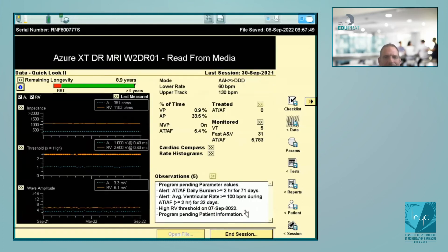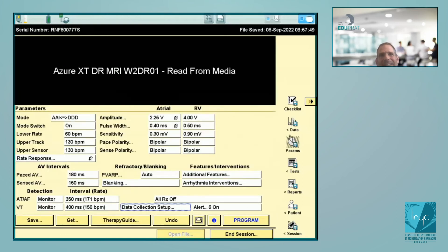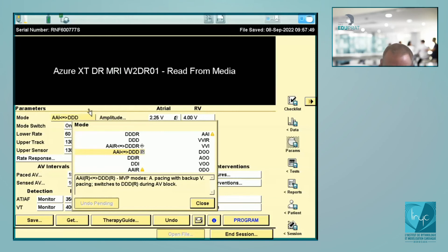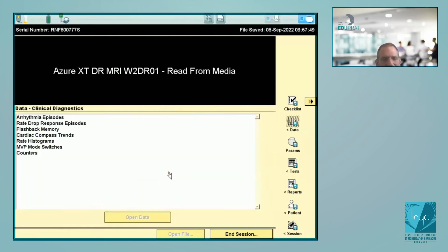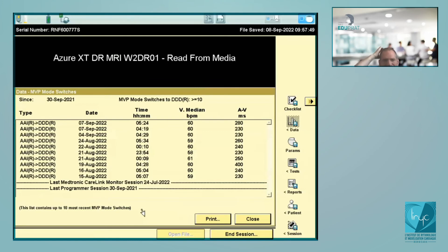One thing to check in a patient programmed with MVP (AIDDDD): in some devices, there is the possibility to record an EGM any time the patient switches from AAI to DDD. In Medtronic, you don't have an EGM for that, but you can go to Clinical Diagnostics and see the MVP mode switches — you'll know how many times and at what time there was a switch from AAI to DDD. No EGM, but this information is important in patients with sinus dysfunction.